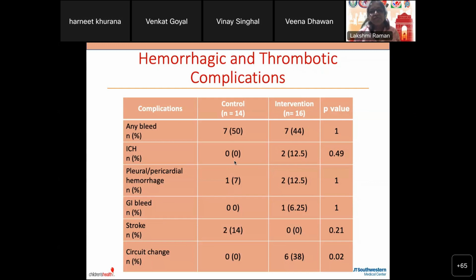But one of the big disadvantages is that because it is enzymatically cleaved, wherever there's a low flow state, you seem to have more clotting. For instance, in connectors, you already see clot forming. And if you are going to do a clamp trial in your VA patient, you absolutely need to give heparin to the circuit. Otherwise, your circuit is going to clot off by the time you do your clamp trial.